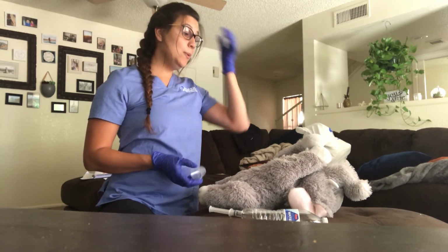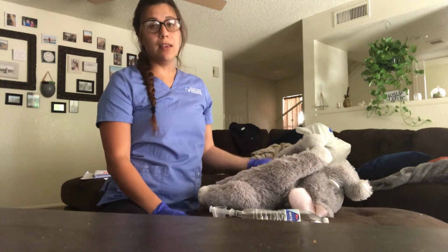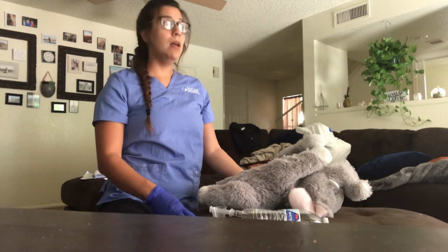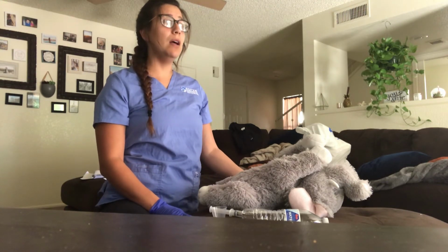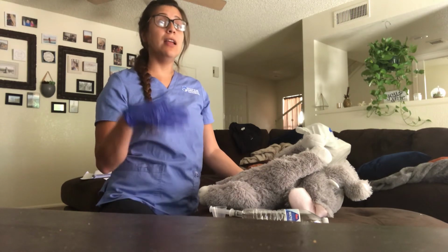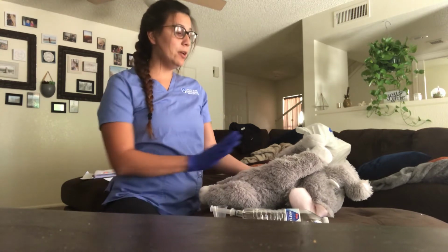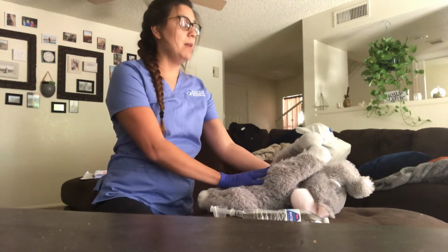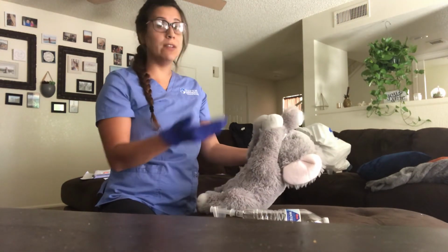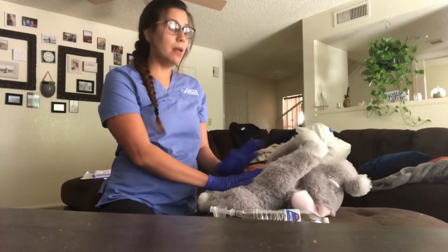So then you want to go ahead and obviously before any medications, give the patient the medication right. So right patient, right dose, right route, right time, right medication. And then the patient's right to refuse the medication. You want to go ahead and elevate the patient to about a 45-degree angle before you start giving any medications. So you would just go ahead and lift them up.